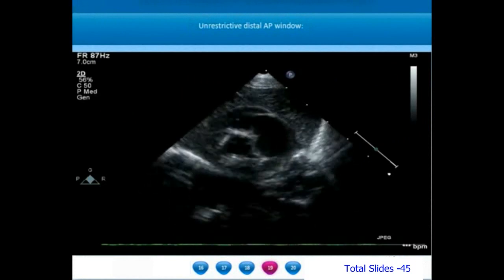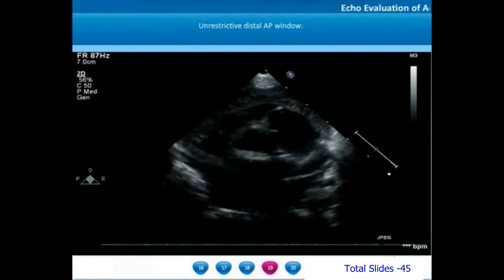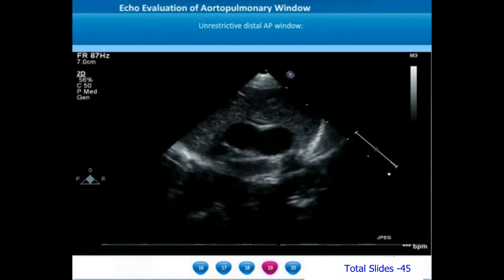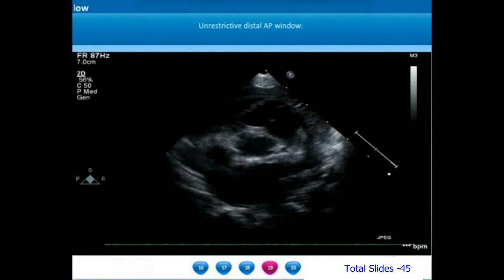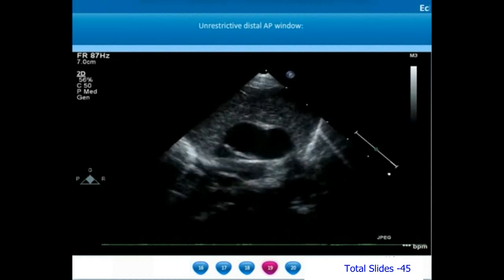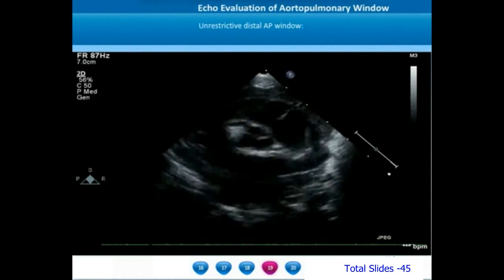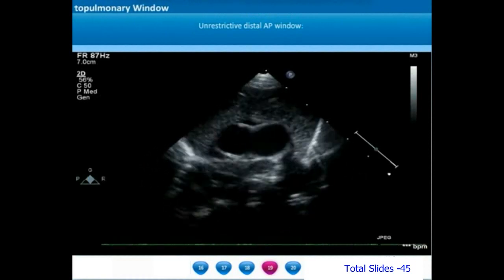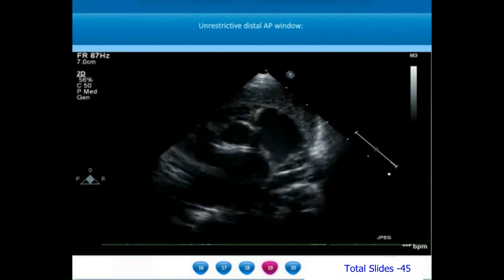On a parasternal short axis view, we find that the distal aortopulmonary window is far away from the semilunar valves. We start sweeping from the origins of the semilunar valves and progressively sweep superiorly towards the ascending aorta. As we sweep more superiorly and reach the pulmonary artery bifurcation level, we observe a large unrestrictive distal AP window. The right pulmonary artery origin is almost continuous with the posterior wall of the ascending aorta — a common feature of distal aortopulmonary window.